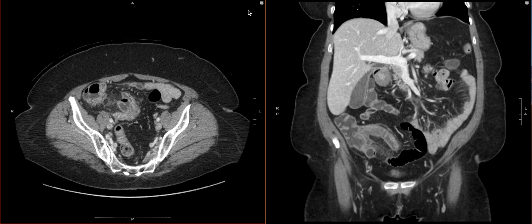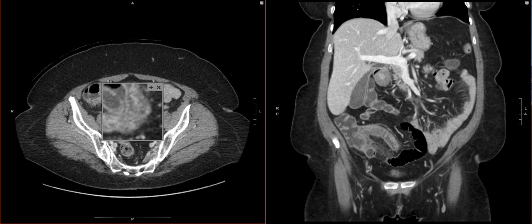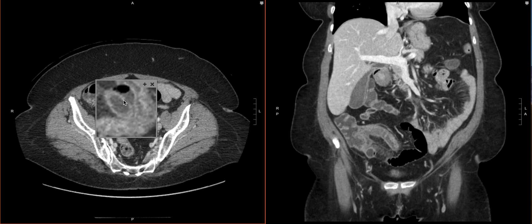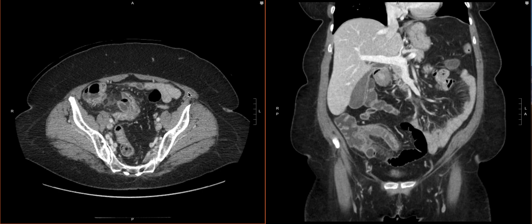And then if we zoom in, what we can actually see is there's a little defect here. So this is a really good look for a perforated appendicitis, which is actually what was the case when it went to the OR. So there's a confirmed perforated appendicitis here.